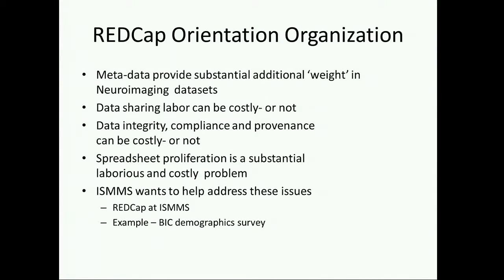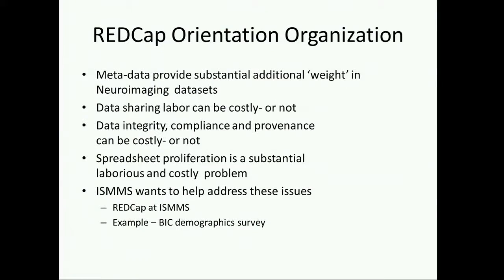I can't say that this reflects a lot of expertise yet, but it really is a very powerful platform for simplifying some of the problems that come up. And Mount Sinai is very much behind this. They run workshops on a quarterly basis now. People are starting to get emails, and they have a very good support office. Maria Supran in particular seems to really love supporting this package, and they want the biostatistics department to be in a position where their consulting and support for people's analyses start from a place where the data are very well standardized and the access is not slowing things down and running up the consulting difficulty.